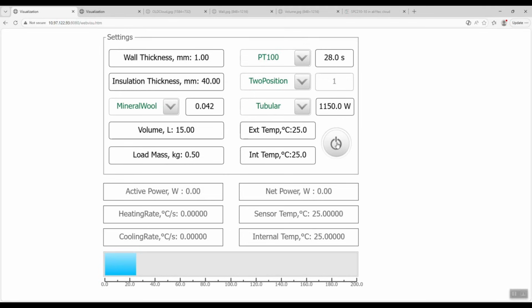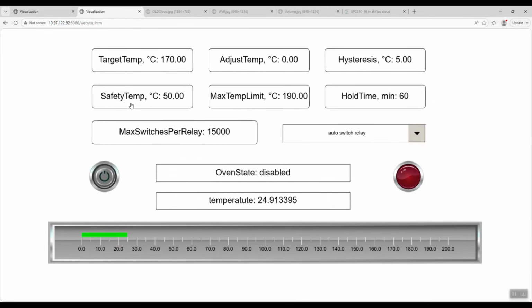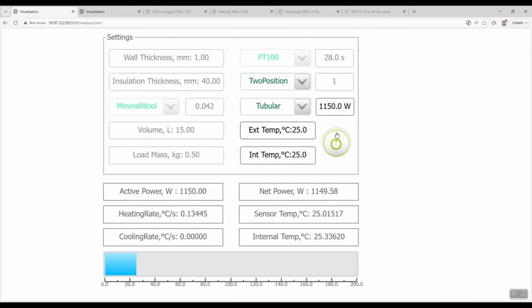Let's press the power button on the enhanced emulator and also press the power button in our main project and watch the process of temperature change in the emulator. The first value is the current active power of all heating elements. It equals the current maximum power of the heater, since the emulator uses a 2-position power control setting, and for now, supports only one heating element.